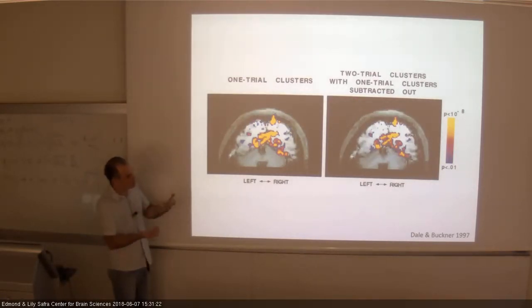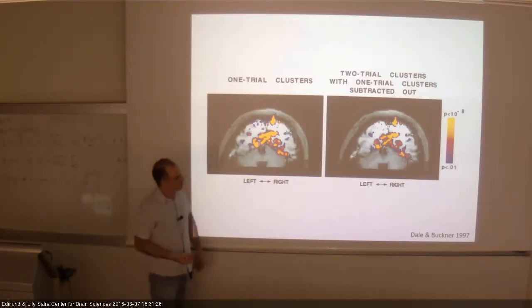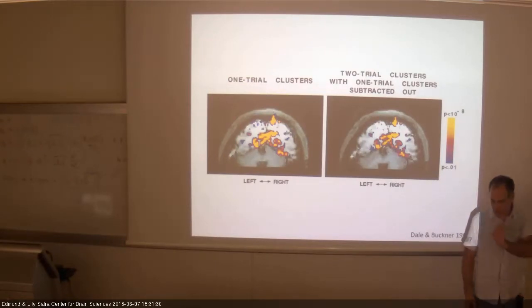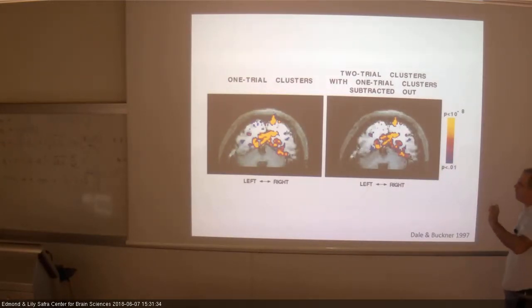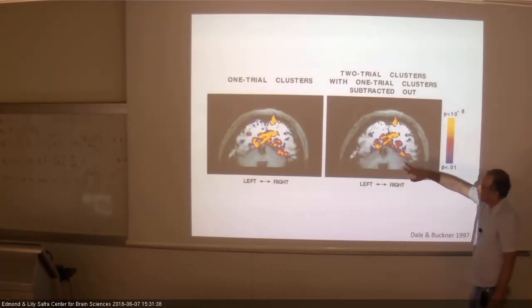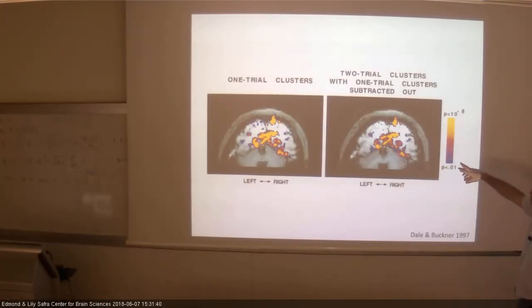They switched this timeline or this activation into basically one value per voxel. Okay, they reduced the data into one value per voxel, and here you can see the distribution of the activity in the visual cortex, and without again going into details, you can see it's strikingly more or less the same.